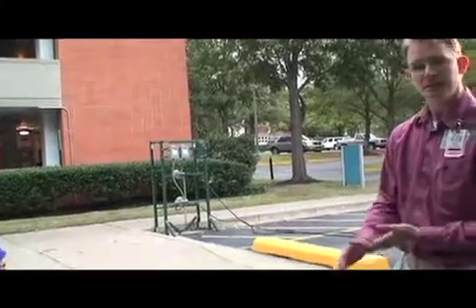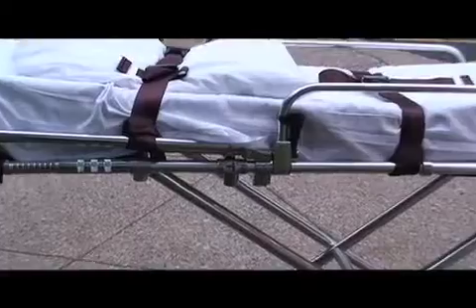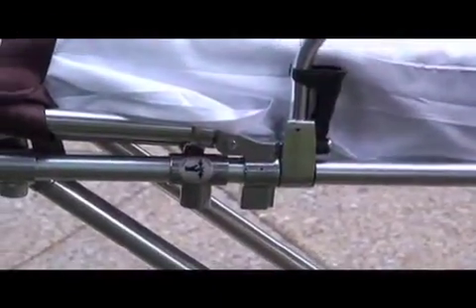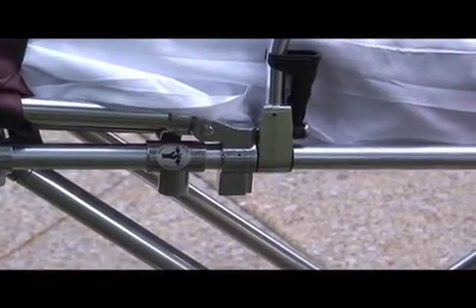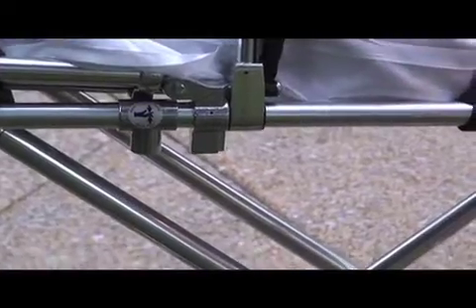Okay. The other thing that I want to point out on the stretcher is the pinch points just to watch out for. When you raise and lower the stretcher, there's going to be a pinch point here, and then there's also going to be a pinch point here, where as the stretcher comes down, those things are going to press against the undercarriage and will pinch your fingers or cut them off. So make sure that any appendages are away as the stretcher goes down.